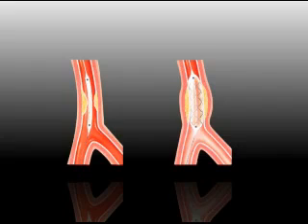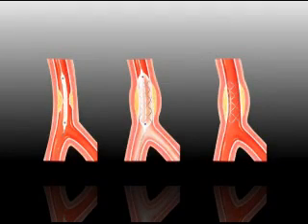One or more stents may be used in a single artery. Additional balloon inflations may be necessary to properly deploy the stent. The balloon catheter is then removed and the stent will remain permanently in place, keeping the artery open. Emergency angioplasty can take 1 to 2 hours, depending upon the complexity of the coronary anatomy.